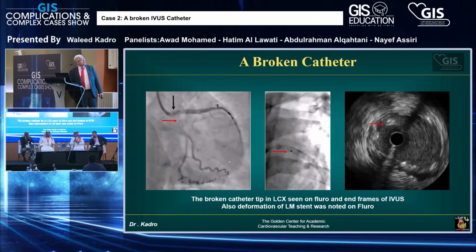So this is a fixed picture just explaining everything. Now, just before we go any further, so this is Boston Scientific, I'm assuming, right? The IVUS catheter type is Boston Scientific, that's correct? And you faced the resistance when you were going in or on the way out? No, just on the way out. On the way out, and then you realized this later on after you built everything? Yes. Okay. So you have a wire in place now, still?